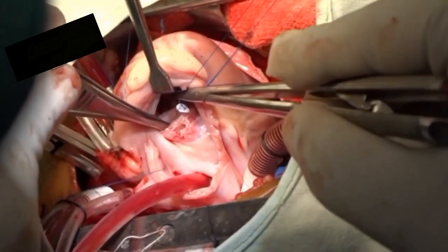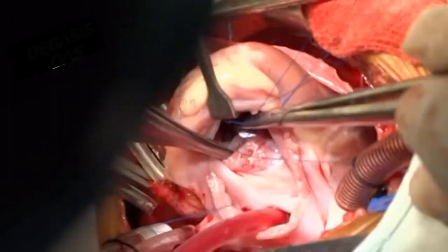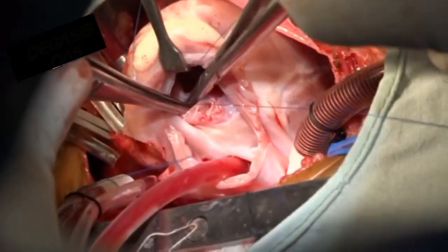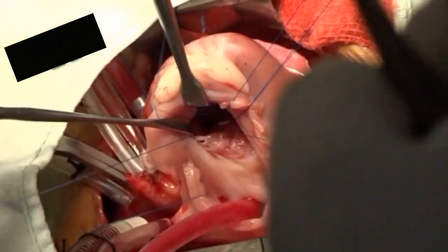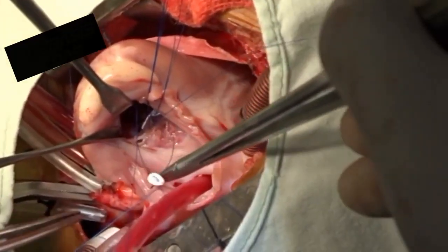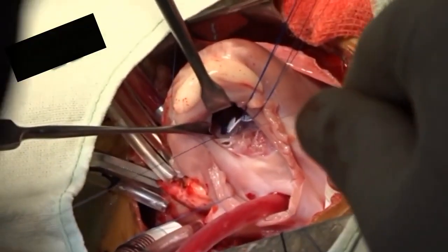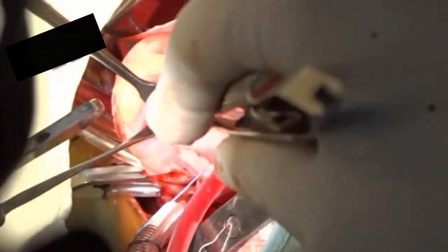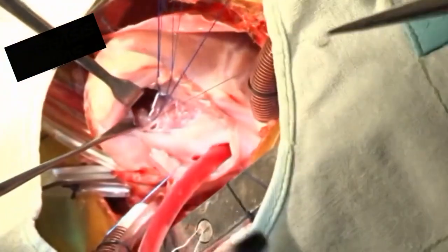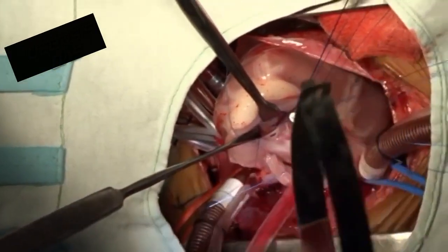Multiple polypropylene pledgeted sutures are then sequentially passed through the VSD margin. At this stage also, retraction should be minimum, as retraction leads to genesis of various arrhythmias in the postoperative period as well as low cardiac output syndrome. The assistant has to be aware of this.